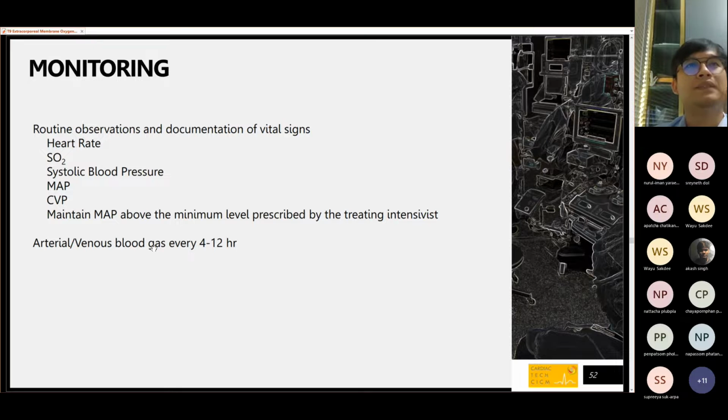Okay, so sometimes we accept only a certain range because now the ECMO patient is in a much more critical condition. So just maintain the patient alive at the minimum level until they can come back by themselves.